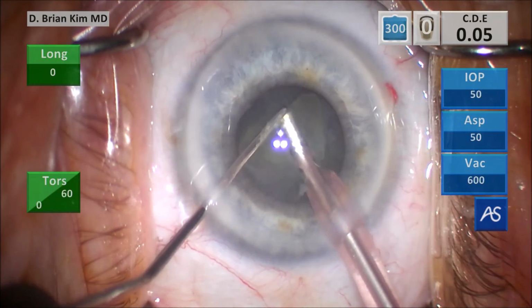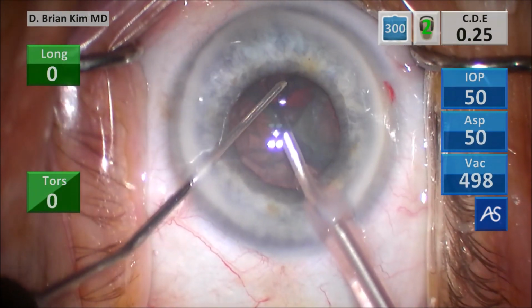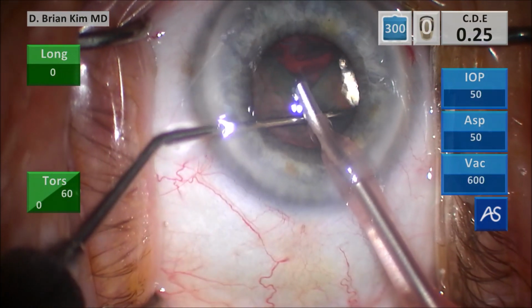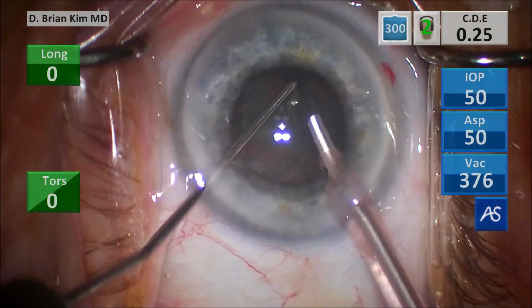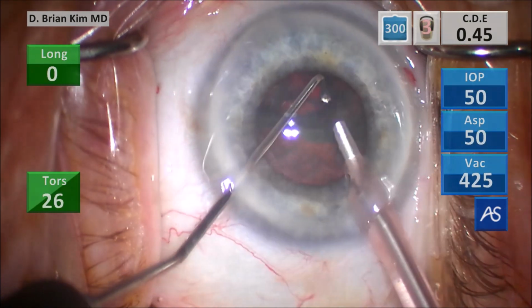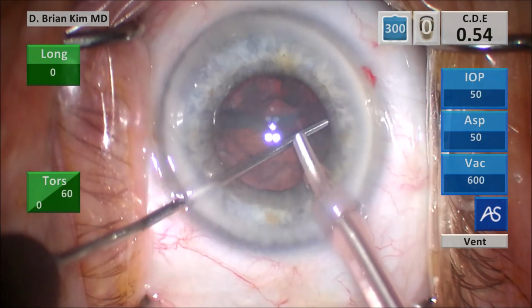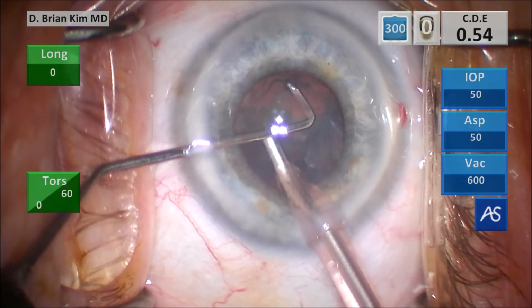Using some vacuum to lift that first quadrant up out of the bag, crushing the lens between the instruments, and then emulsifying the lens pieces. Placing the chopper around the second quadrant, pulling it towards the phaco tip with another cross chop maneuver, and then emulsifying the lens pieces.